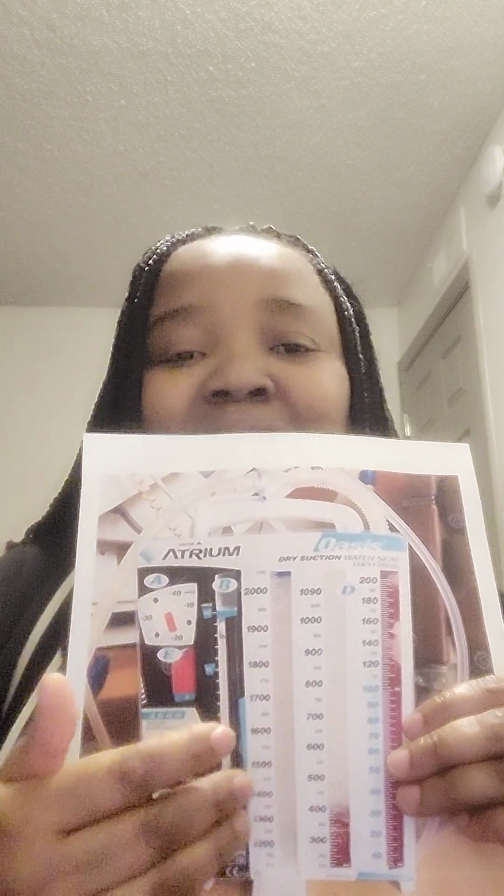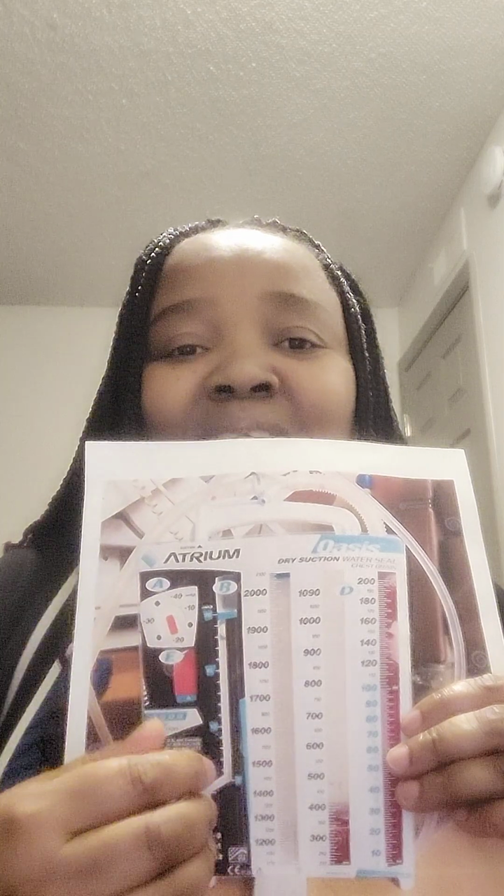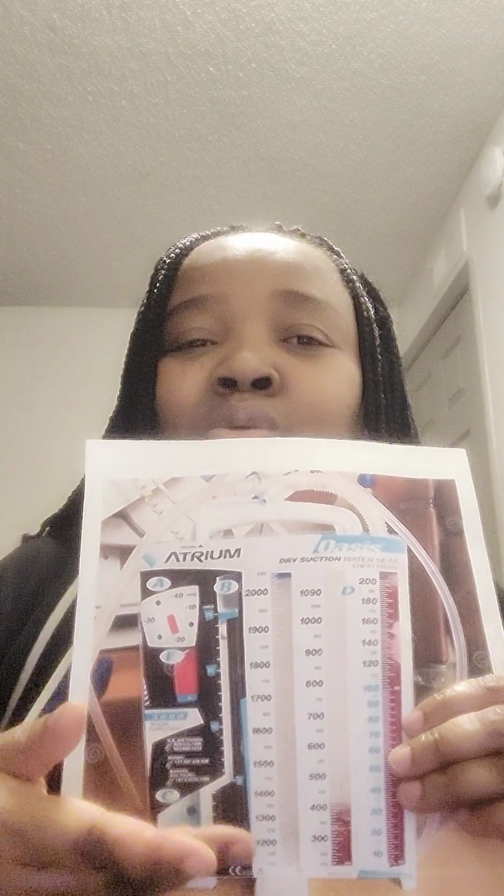One way to tell the difference where the leak is coming from is if the leak is intermittent and it goes in the same direction with respiration, there is a possibility that the leak is coming from the pleural space, that's inside the patient. But if it is just increased and constant bubbling, then the chance is that it is from within the tubing outside the patient.